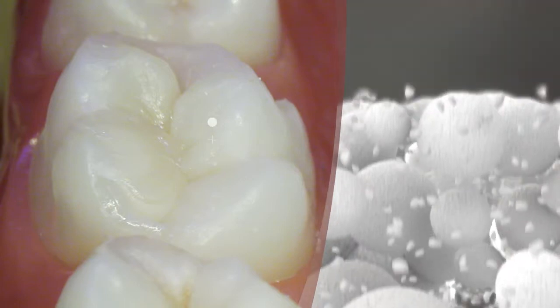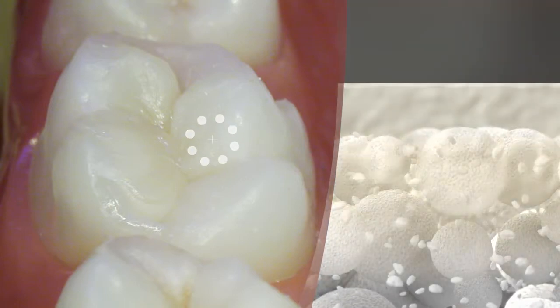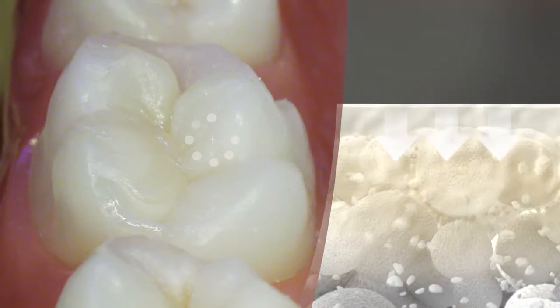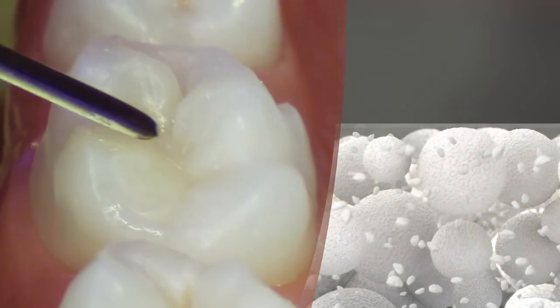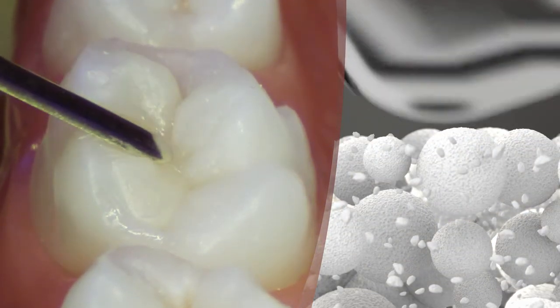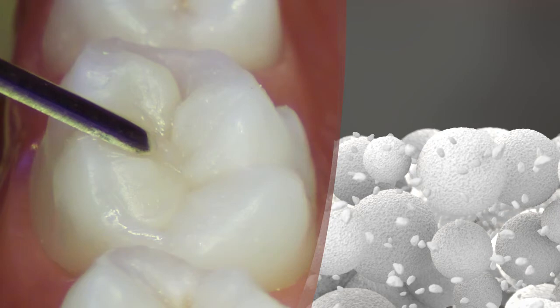The microgranulated structure of SphereTech is able to bind more free resin compared to usual fillers. As a result, Ceramax does not stick to hand instruments.